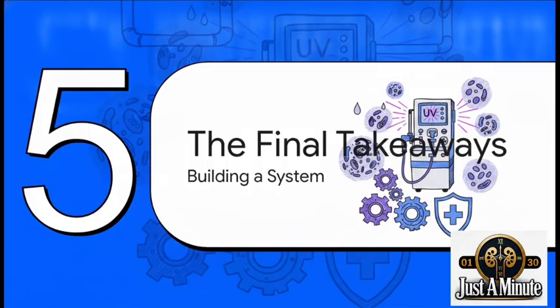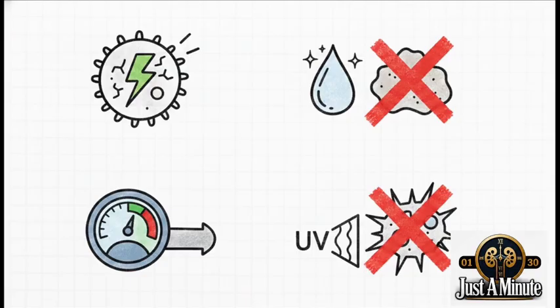Section 5, The Final Takeaways, Building a Complete System. So, the crucial point is, how does this highly specialized tool actually fit into the broader objective of keeping patients safe? Let's quickly recap the absolute essential rules. 1. UV inactivates via DNA damage. Again, it is not a filter. 2. It absolutely requires clear, particle-free water to eliminate those shadows where microbes can hide. 3. Proper flow is essential to ensure adequate exposure. And 4. It cannot remove endotoxins. Honestly, locking down these 4 fundamental concepts gives you a massive advantage in understanding how water purification logic actually works.